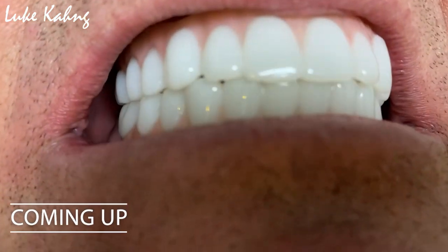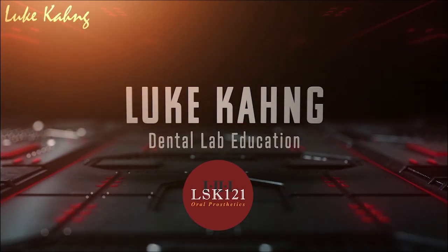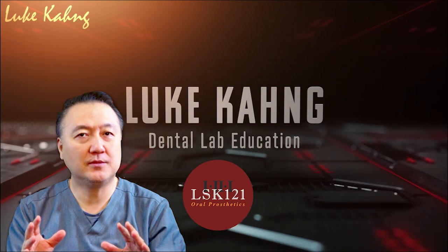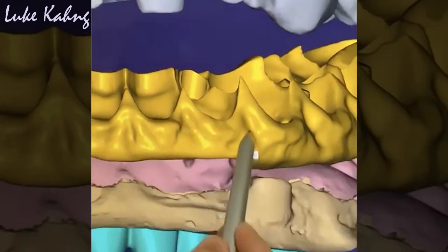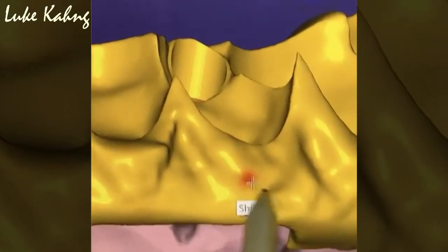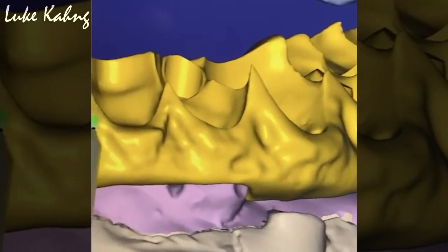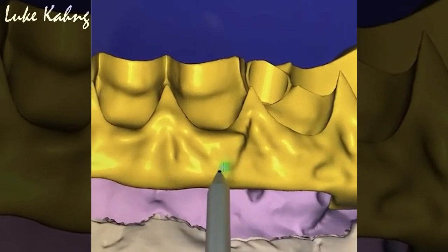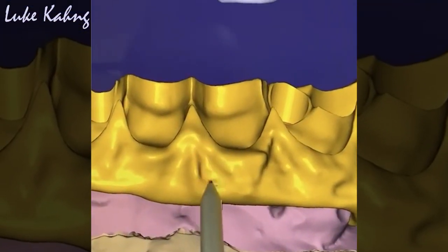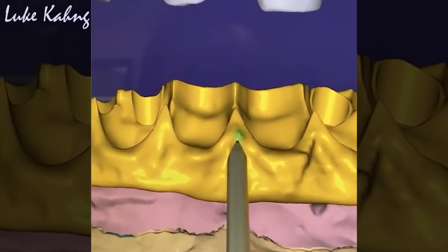Look at this bite, you see? Yeah, love it man, this is what you want. Now we just find our tissue character for the printing. That's good, make more detailed contour — this is the implant. All right, let's get more detail with the pencil.